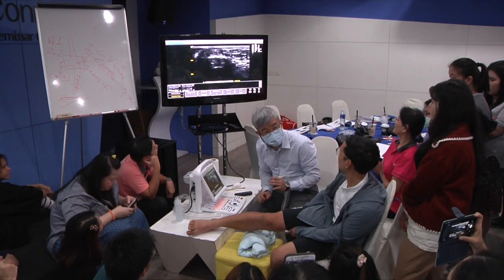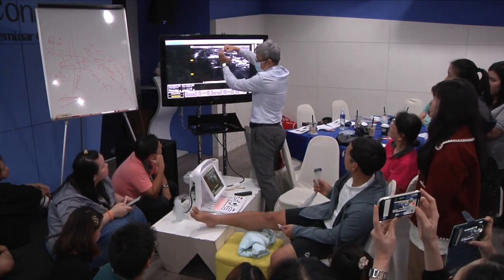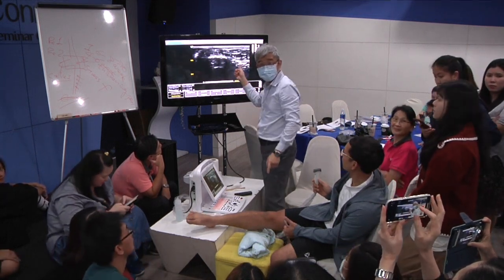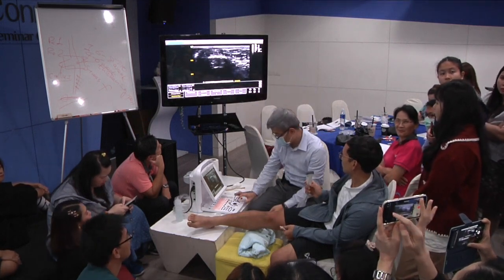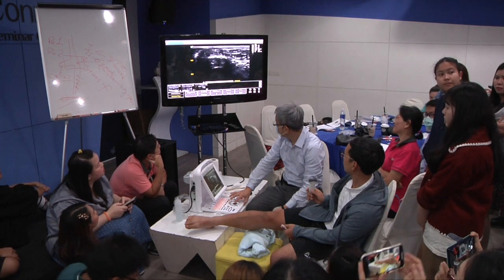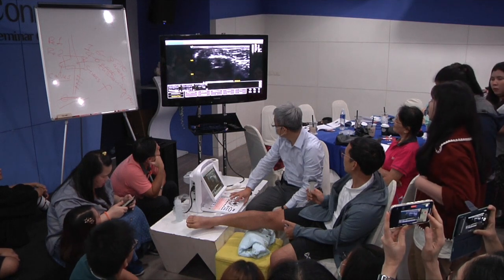Can you hold? It's like this one, then rotate. Right, you can see that? If you can understand, I think it should be okay, because from your distance. Rotate again. Oh, sorry, the wrong direction.